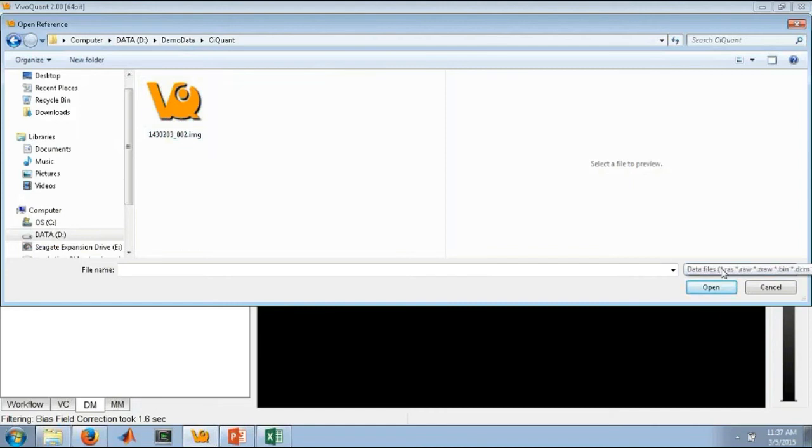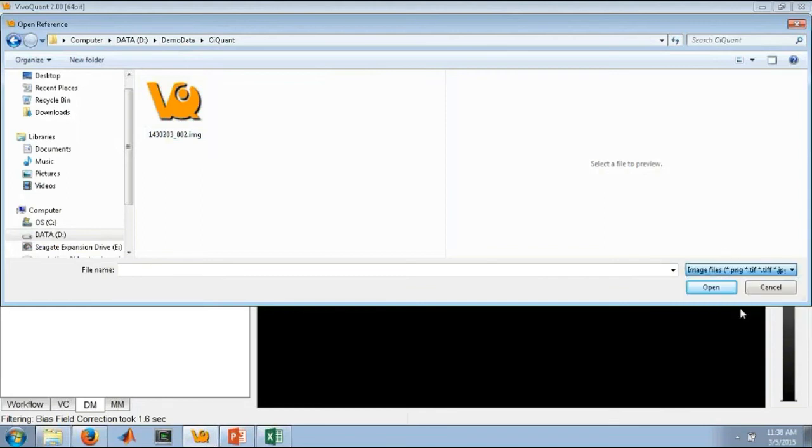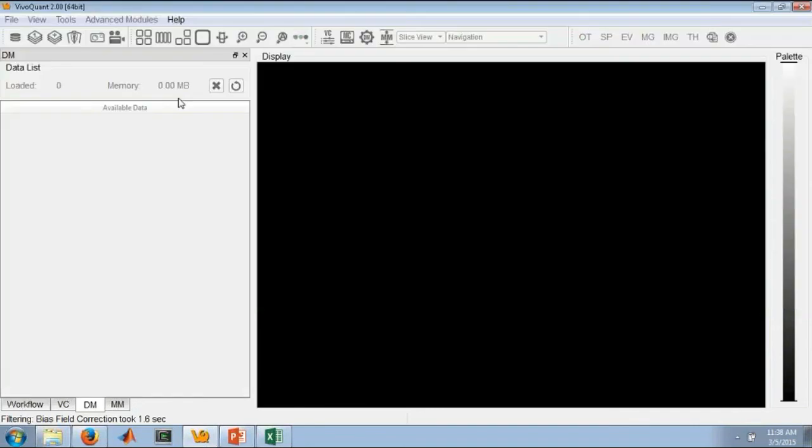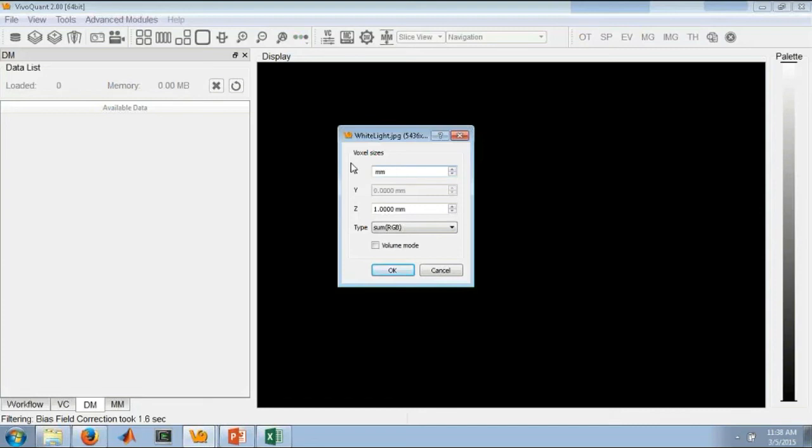One thing to point out is that if you are loading, whether it's a JPEG or a PNG, you do need to change what data sets you're looking for. For instance, I want to look for image files. And here we have our white light JPEG image. The first thing that will come up is a prompt to ask me the voxel sizes of the image. This is something you'll have to know going in. For instance, I know that this image is 0.0442 millimeters. It's only a single slice, so I don't care too much about the slice thickness.